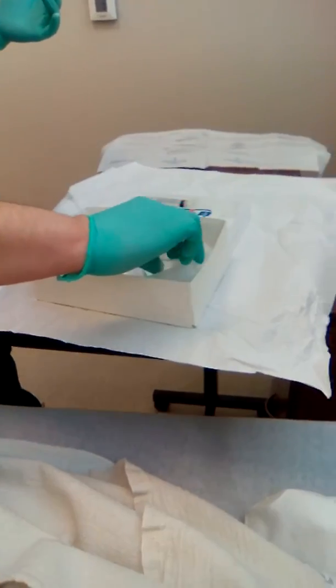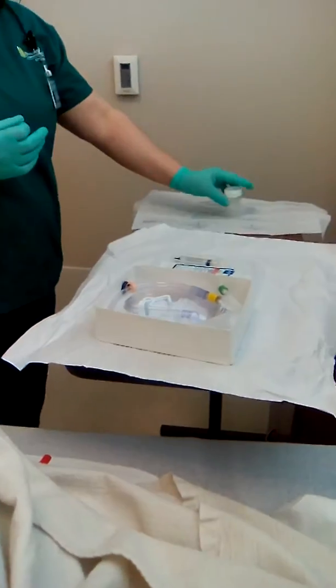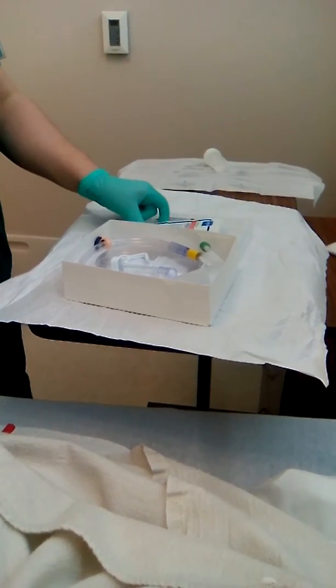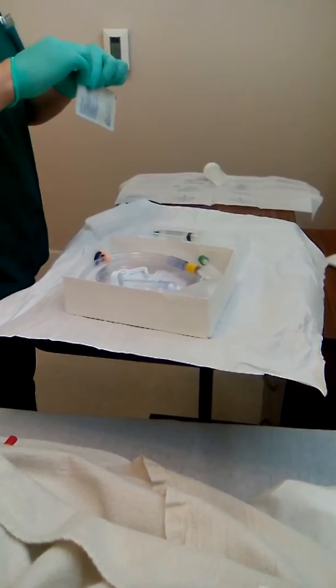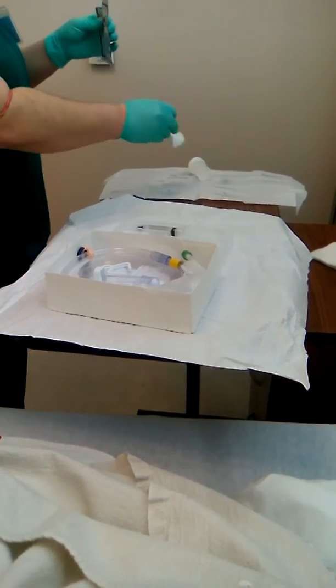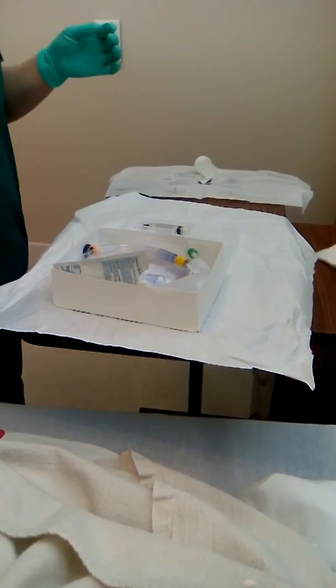I'm going to get rid of this. I am going to open my alcohol swabs. I am going to place them in my bucket.